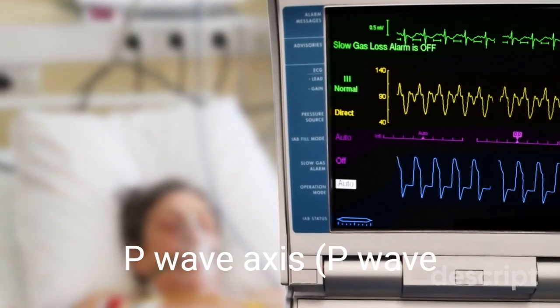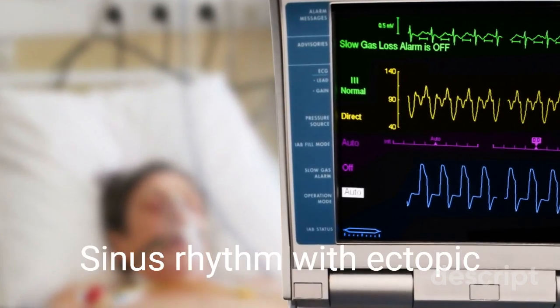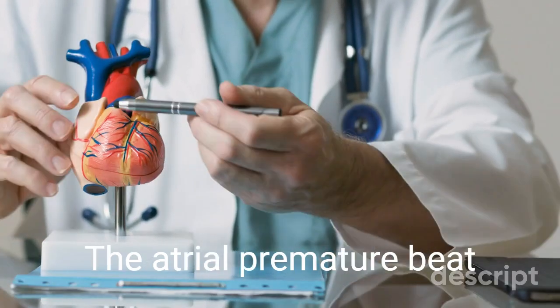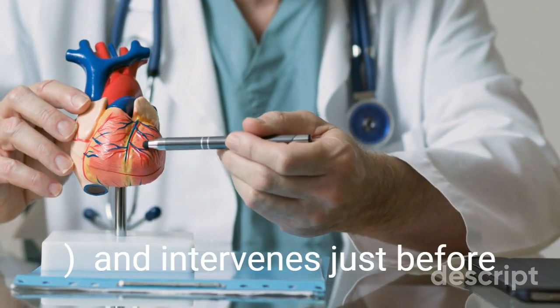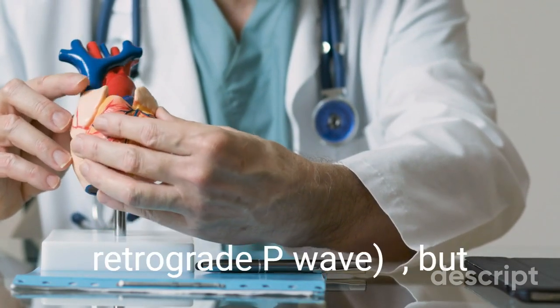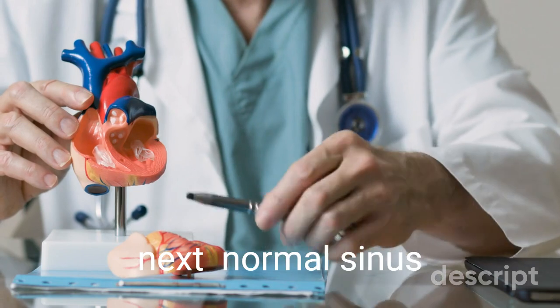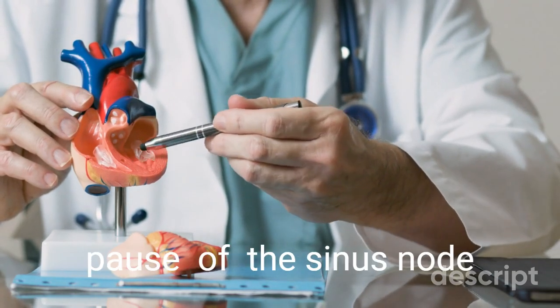1. Sinus rhythm equals normal P-wave axis that precedes the QRS complex. 2. Sinus rhythm with ectopic beat. The atrial premature beat has a P-wave that has a different shape from the sinus P-wave and intervenes just before the next normal sinus. Premature junctional beat looks like a junctional escape beat, but the PJC intervenes before the next normal sinus comes, but a junctional escape beat occurs following a long pause of the sinus node.